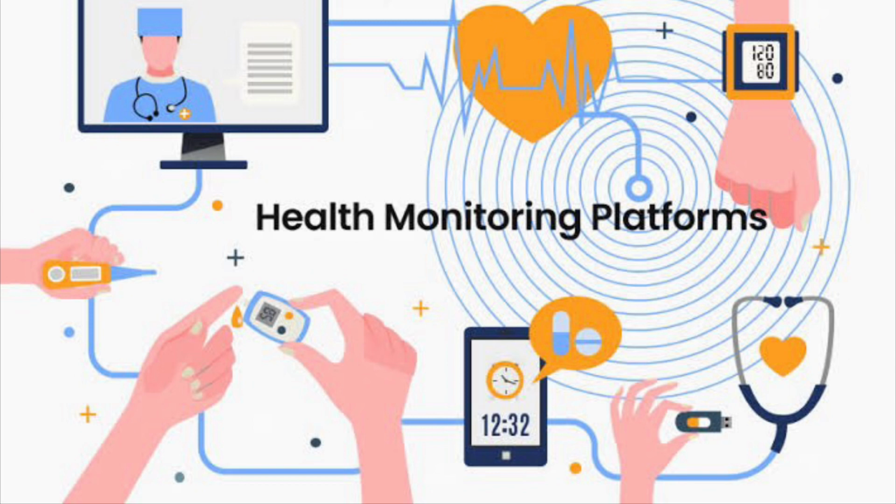The chance of picking up something is not financially viable, or it is not feasible for somebody to go through this large amount of data and monitor a large number of patients. And second, if it's remote monitoring, then one has to identify which subset of patients needs to be monitored. Patients who are sent back from hospital after surgery. But naturally the problem is somebody has to monitor whether the wearables are used properly, because if any lead comes off, then naturally it will raise a false alarm.